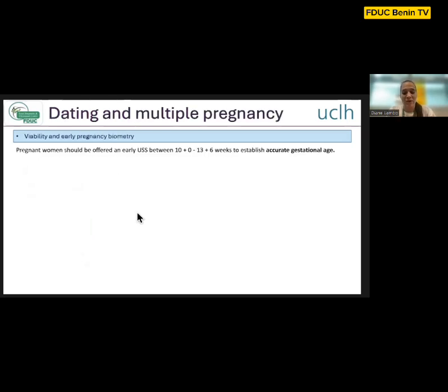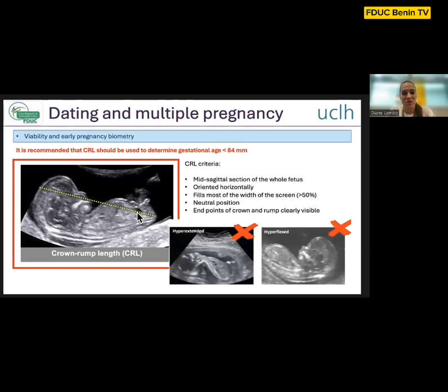So we've determined our chorionicity, and now moving on to dating the pregnancy. Now, again, this is familiar territory. I covered this last week, but just as a refresher, the way that we date the pregnancy is between 10 up until around 14 weeks gestation. This is the window in which you're able to provide the most accurate date of the pregnancy. And of course, the way that we do that is by measuring the crown rump length in order to give an accurate gestational age.